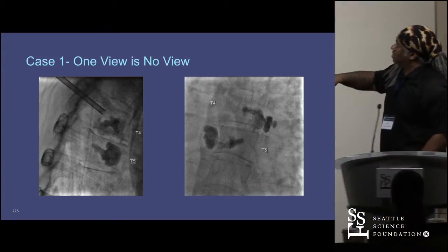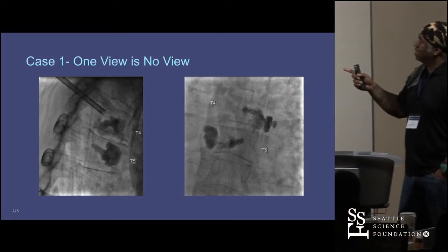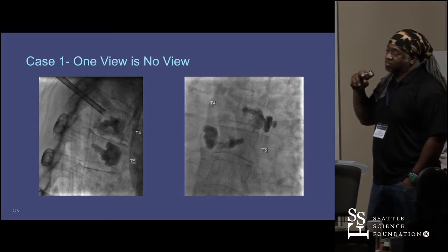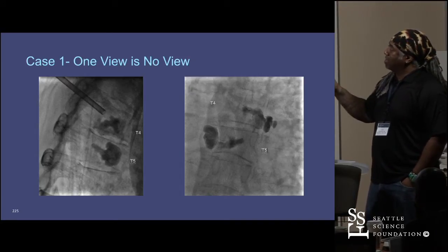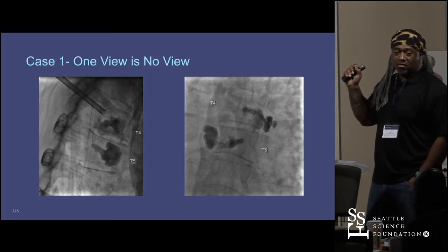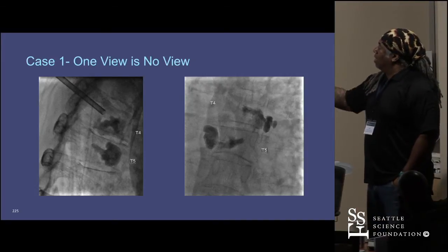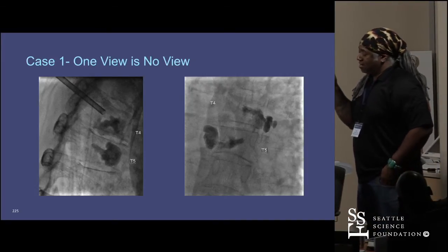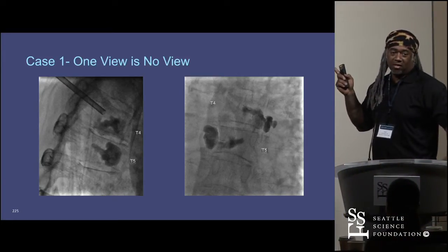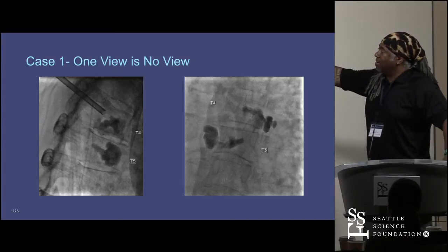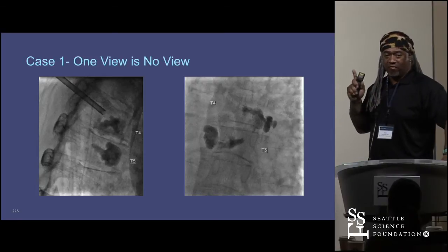Pay close attention to the images here on your left. I'm doing this case — this lady actually had a solid tumor. She's already been ablated, and that's not really the point here. One of the things I've noted: one view is no view. It's something we use in plain film reading. One of the things I'm looking for is interdigitation when I'm starting my fill. I'm calling this the smooth margin sign — anytime you're getting smooth margins, you're filling a void.